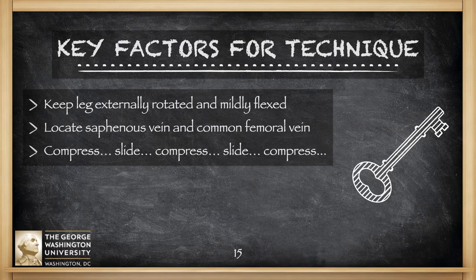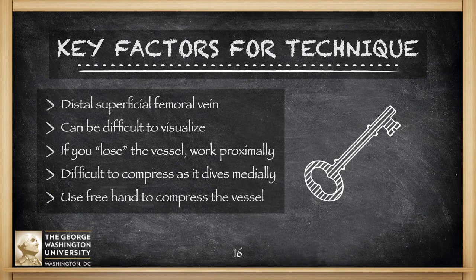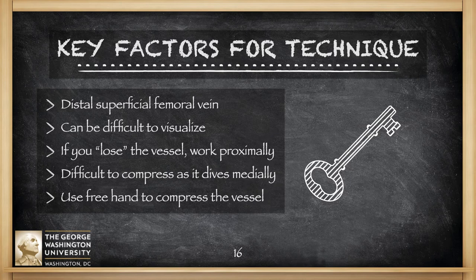Once you lose it behind the femur, you basically pick up the probe, migrate it behind the popliteal fossa, and look for your popliteal vessels. You've got to see that distal superficial femoral vein. In some cases it will be difficult to visualize, so you might have to adjust your depth and gain slightly. If you ever lose the blood vessel, just go back proximal and try to locate where you were. If you cannot compress it, think about whether you have a firm base — are you compressing against the femur or against your hand? Because if you push the probe down toward the bed, you may not get enough sandwich pressure to compress the vein.